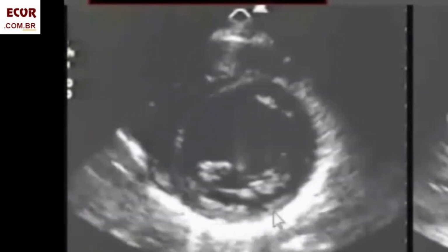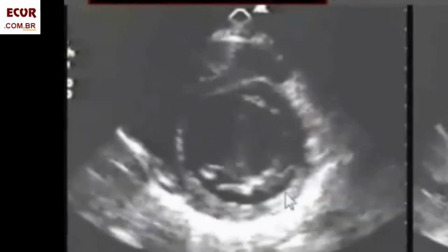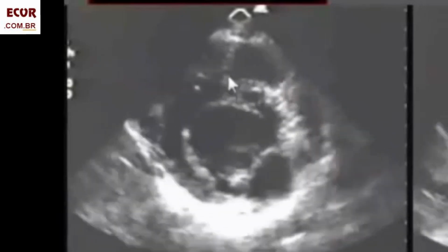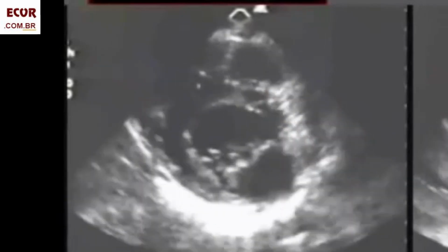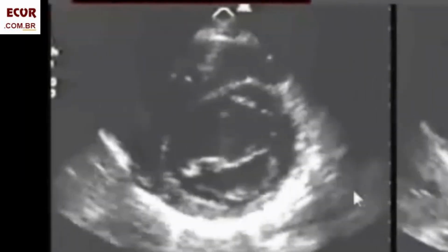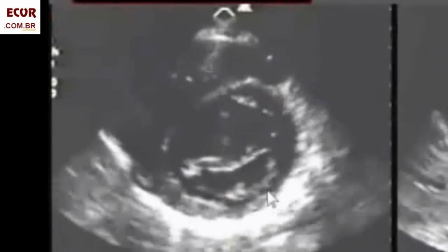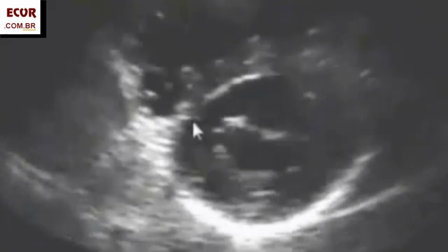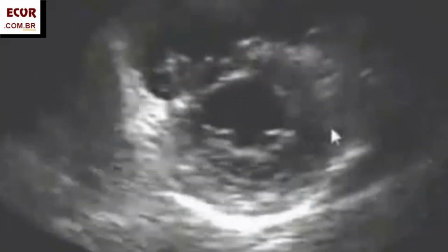You may have the impression that this region here is dyskinetic. Everything is contracting well except for this region that is expanding during systole. This is not dyskinetic. In a perfect short axis, there is no dyskinesia, but in an oblique view, this here is the mitral ring. We're entering already the left atrium. This region here of the inferior IV septum may also deceive you. Many normal walls may seem to be hypokinetic in this region.